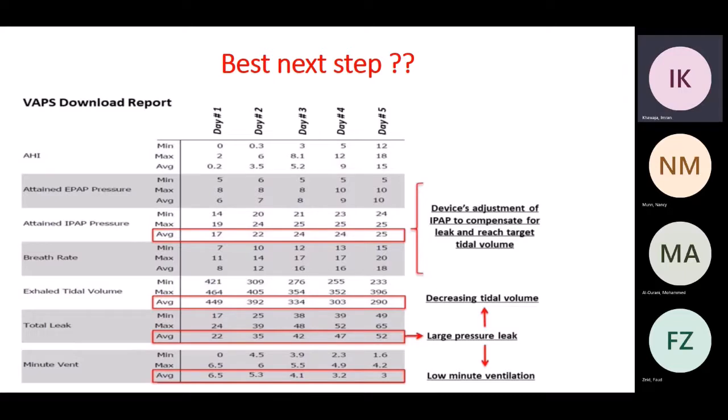Yeah, no. My question is, how do I know what is the acceptable leak for every patient, and the intentional leak?